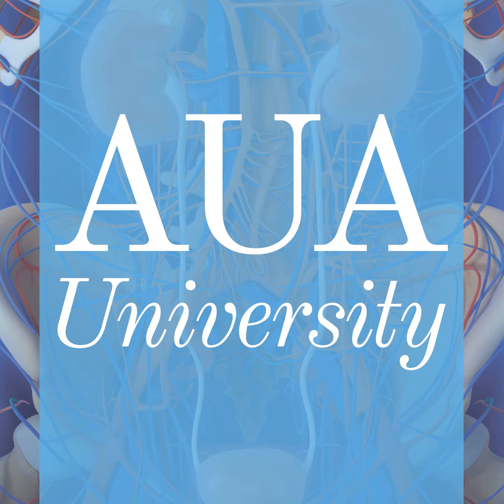treat prostate cancer now, especially in biochemical recurrence. And I think out of all the disease states we see, the most relevant place for a PSMA PET is in the evaluation of biochemical recurrent disease. And obviously PSMA is the imaging agent of choice.